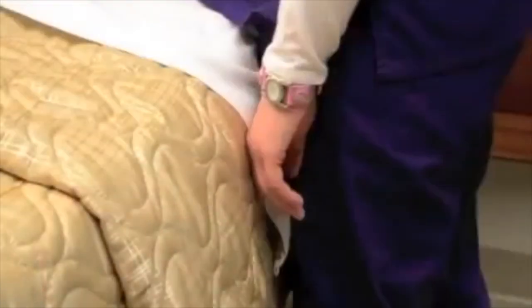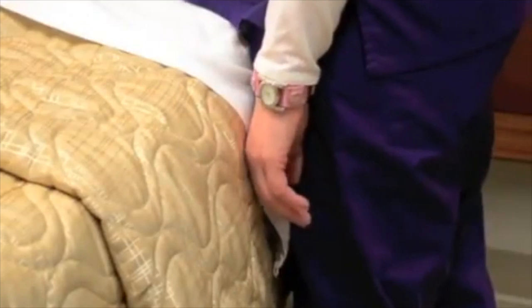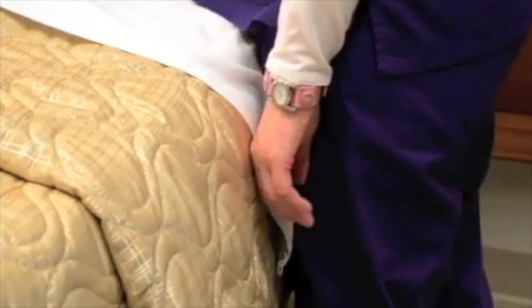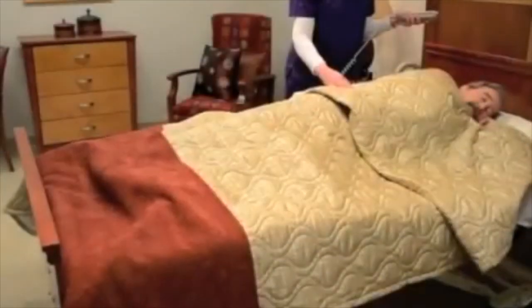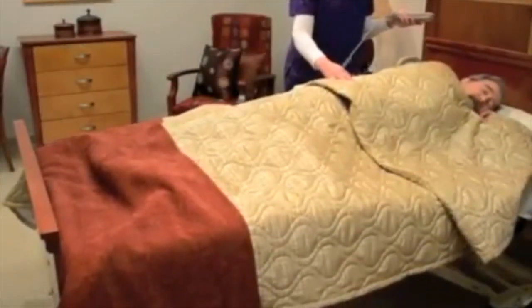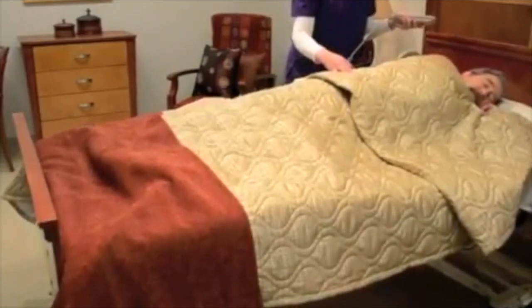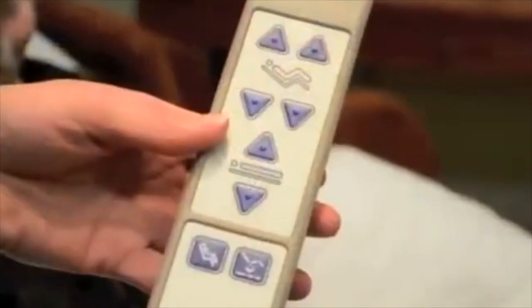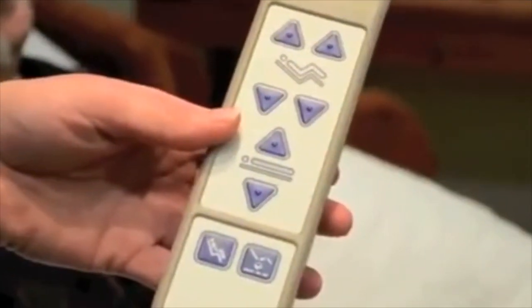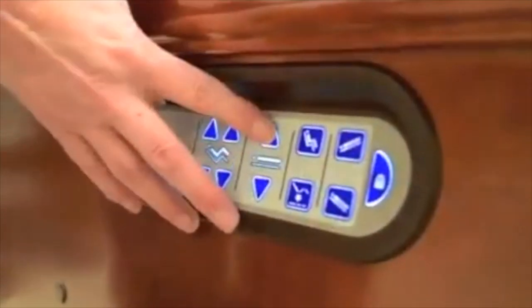A bed is at a safe ergonomic height when raised to a height that is generally between the caregiver's waist and their knuckles. When raising the bed to a safe working height, or when lowering the bed, press either the up or down arrow located in the middle of the pendant, or you can raise or lower the bed using the staff control.